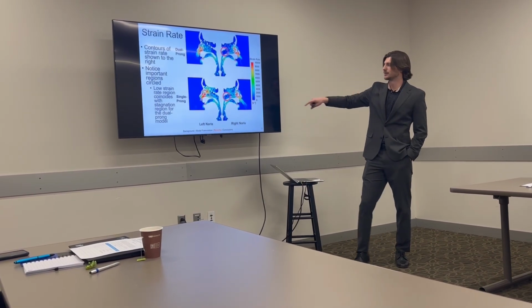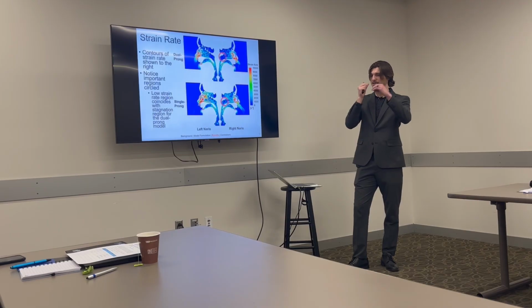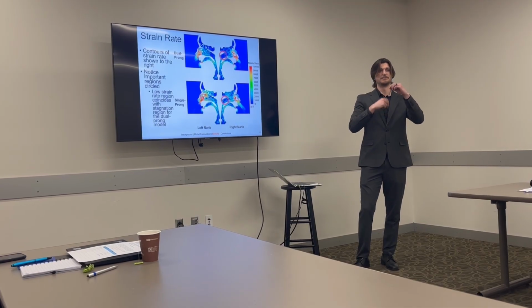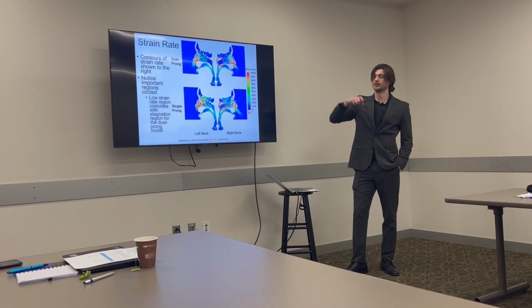This is a region where we would expect higher mixing for the single prong geometry, as the therapy flow is moving from the left nasal passageway, mixing with that expiratory flow in this region, and then moving back out the right nasal passageway.